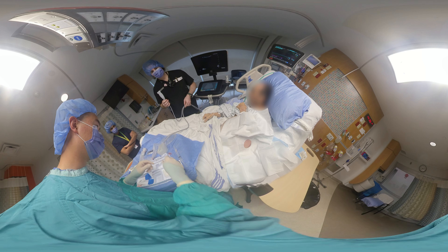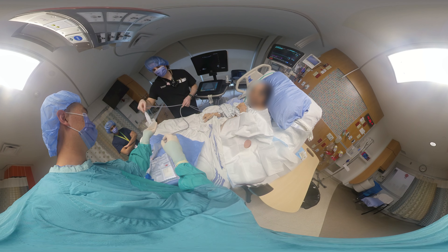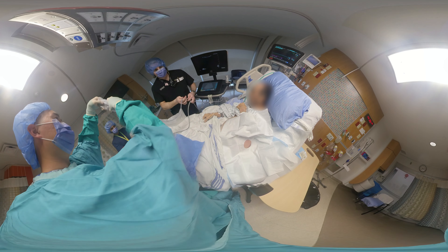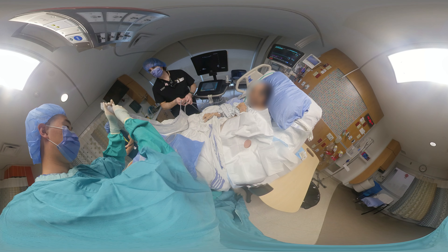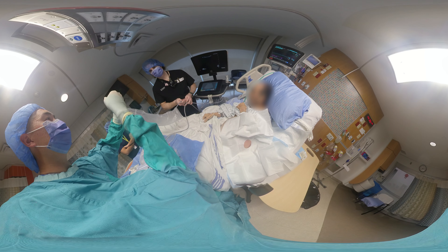Usually do this in advance of the procedure. If you're able to, use both probes to locate the site, make sure there's no vessels, and then mark it. You're welcome to prep and drape after, which reduces the need to put sheets over the probe during the procedure.